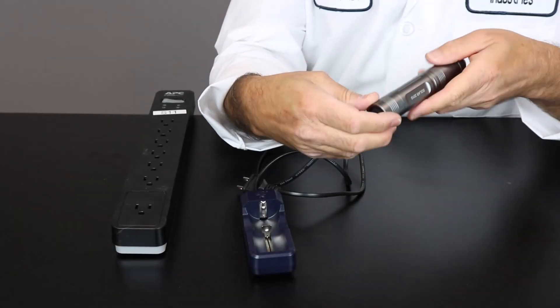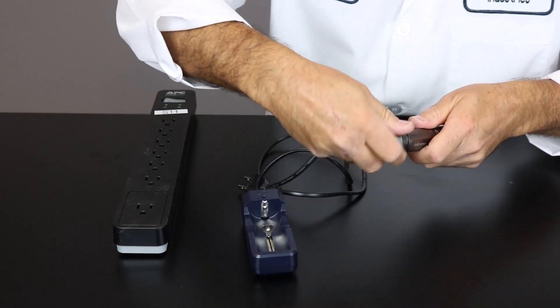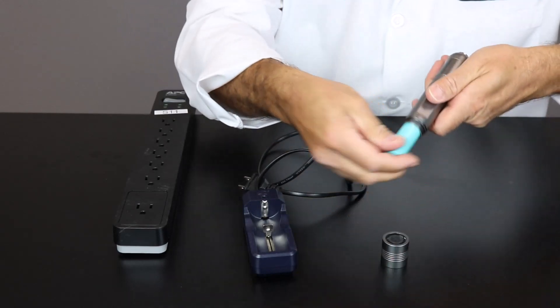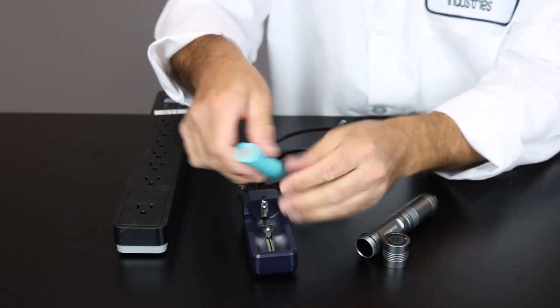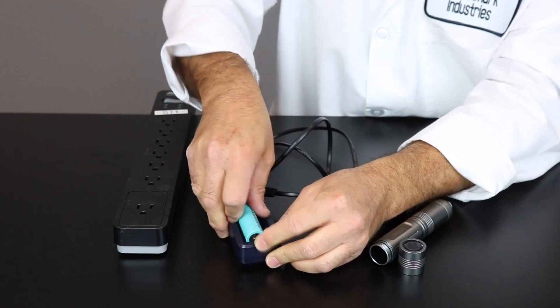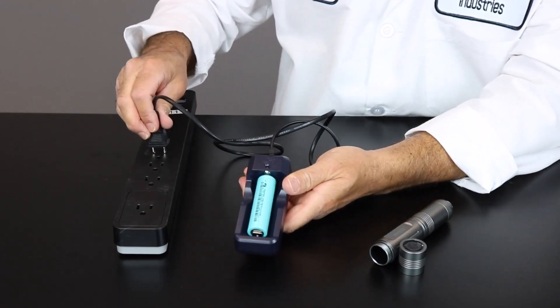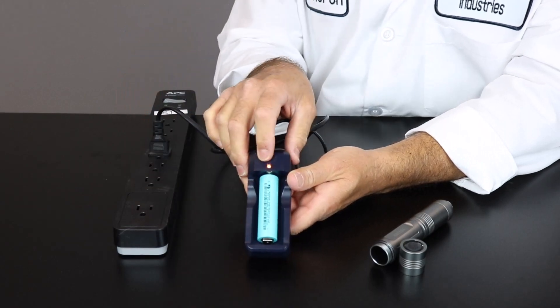To charge the light source battery, you're going to simply at the proximal end, unscrew the light source and slip out the battery. Then you're going to push back the metal mechanism, making sure that the positive side is towards the proximal end. Simply plug in the unit and the indicator light will go on.